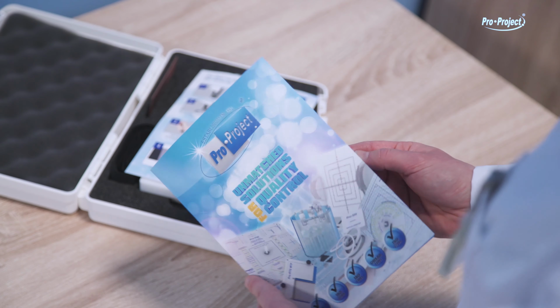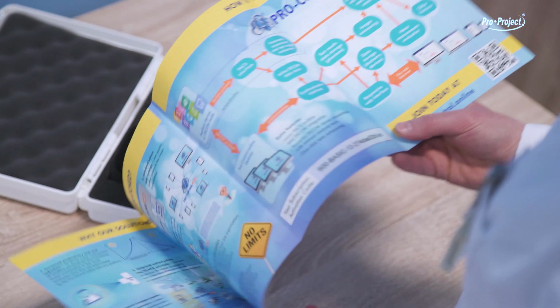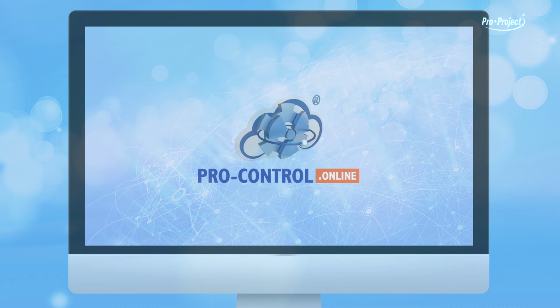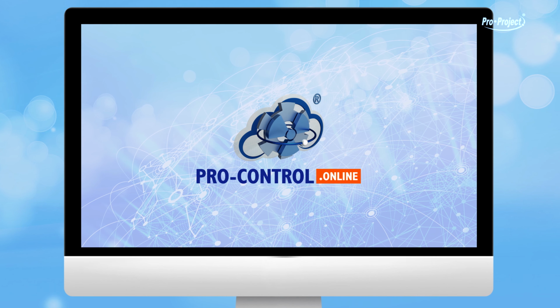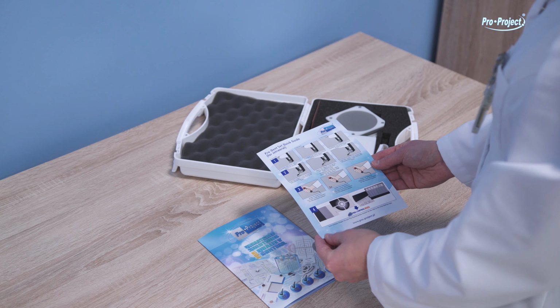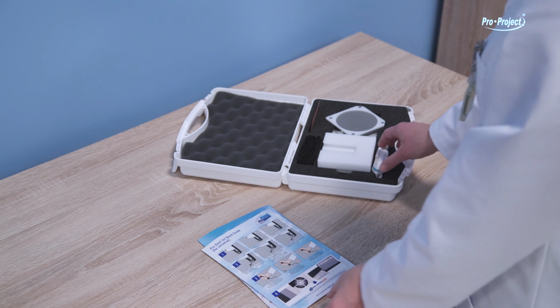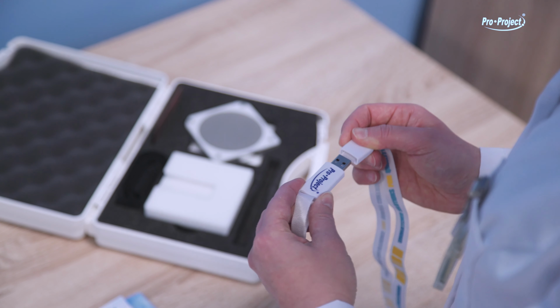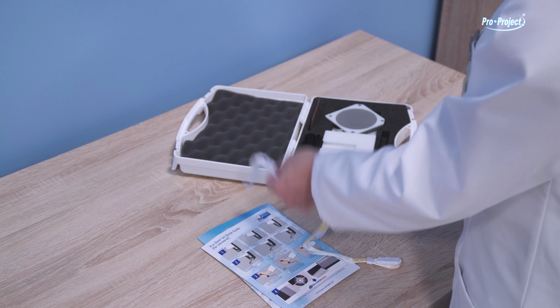The kit contains Pro-Control.online automation software leaflet with the subscription activation code. To create your own account, go to Pro-Control.online website. Abridged manuals. Manuals and documentation on a USB drive.